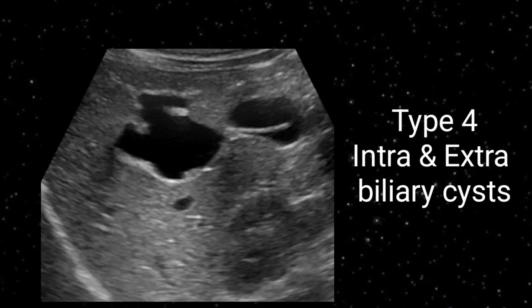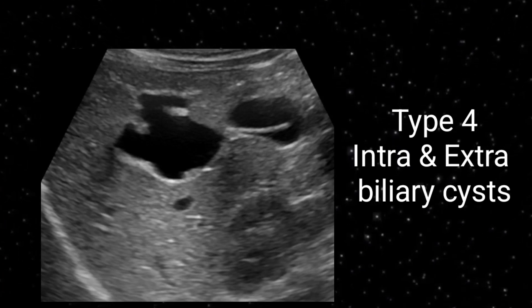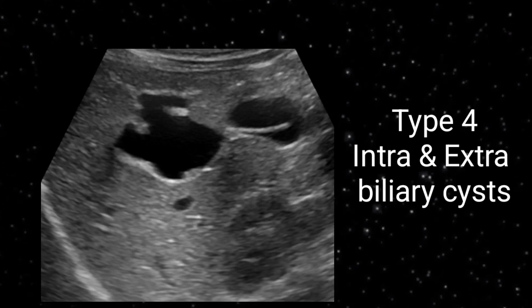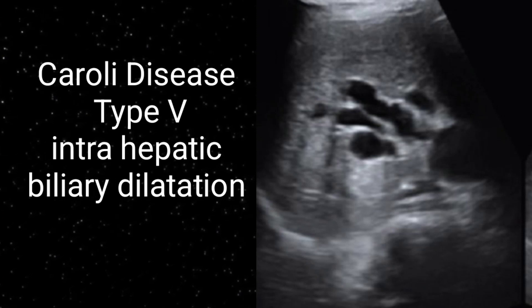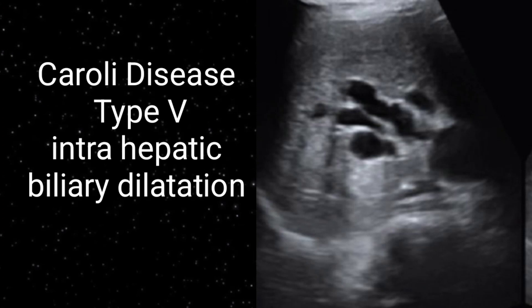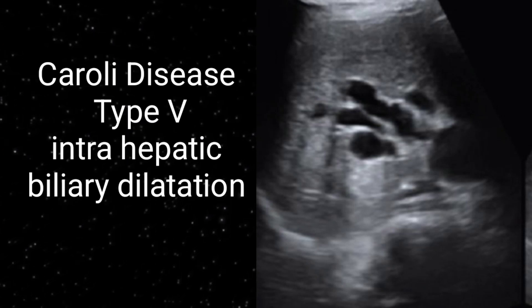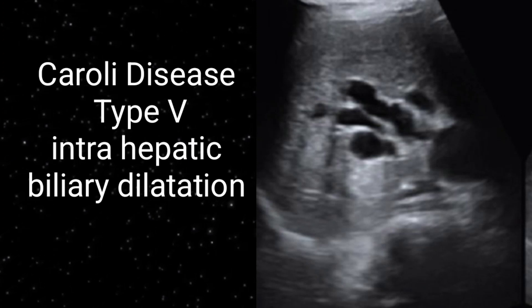You can see both intrahepatic and extrahepatic cystic lesions. On the report, mention the size, the structure, and write down that Type 4 choledochal cyst is seen. On ultrasound images, if the liver parenchyma shows multiple cystic dilatations involving the entire parenchyma or any focal segment of the liver, this would be Caroli disease — these are Type 5 choledochal cysts.